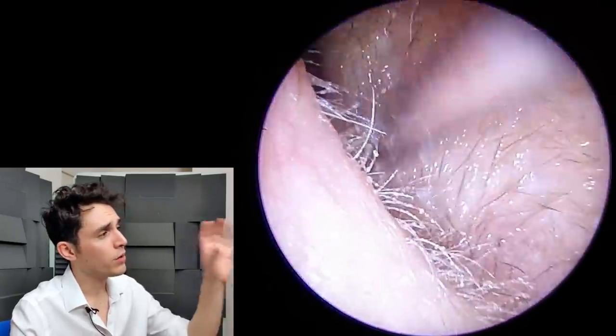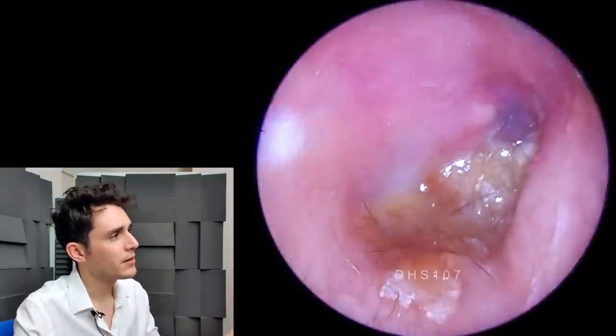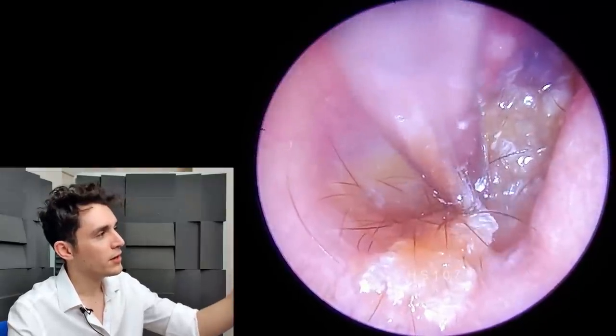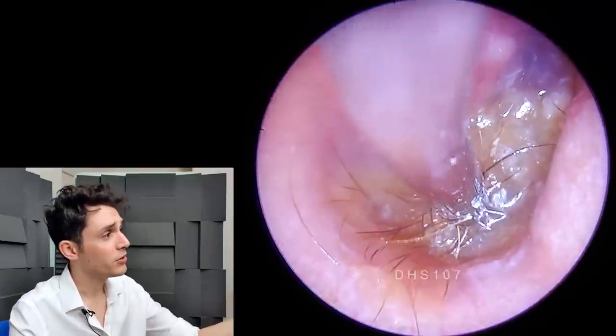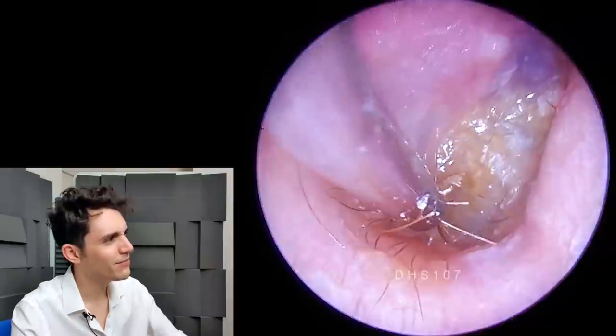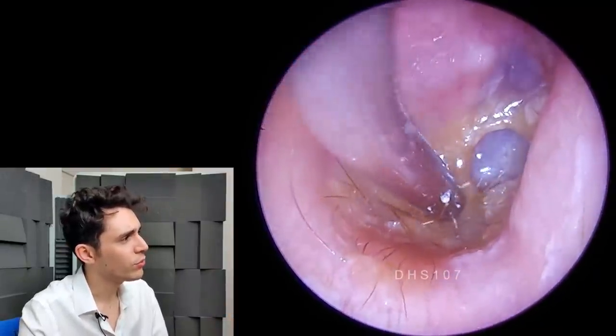This is how it looks after one round of irrigation with the Projet — significantly better. I can now actually see what I'm doing. The eardrum is clearly visualized there, that sort of grayish, bluish tissue. But it still has some residual slime and hair on it. Going in and suctioning that away — it's very thick and resistant, and the hair is creating a significant problem.